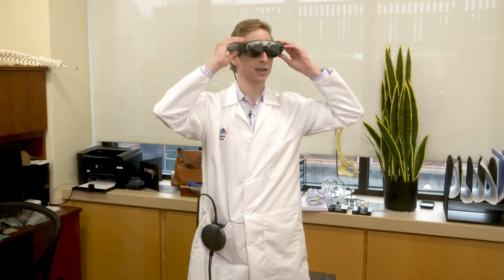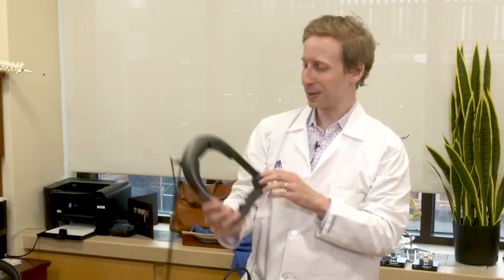Well, that was awesome. I just used an augmented reality program to look at my patient's specific anatomy, fusing his CAT scan and his MRI together, looking at this beautiful model and analyzing what approach we should take, explaining it to the patient in detail, who now walks away with a much more thorough understanding of his specific pathology and what we're planning on doing.